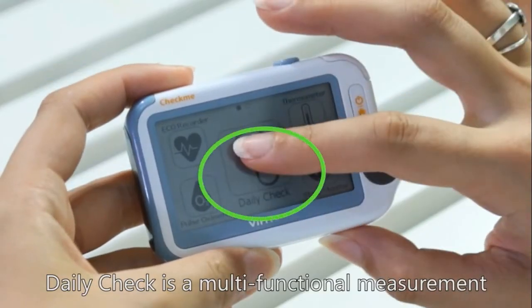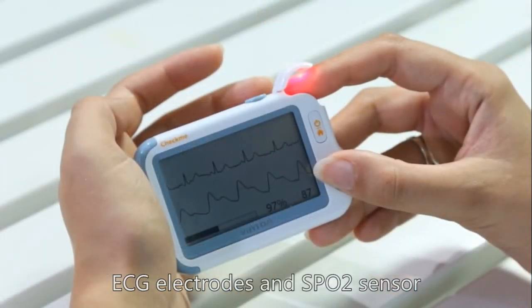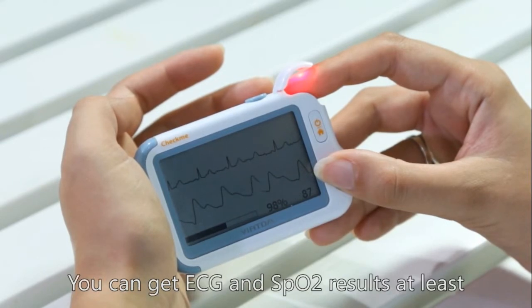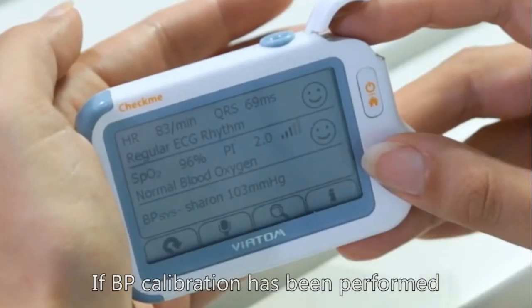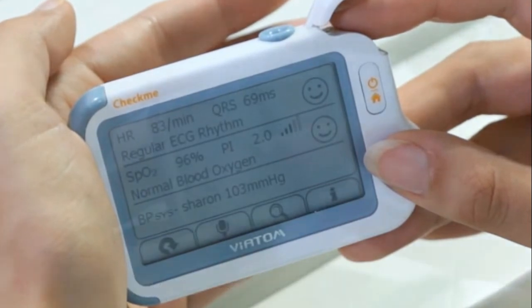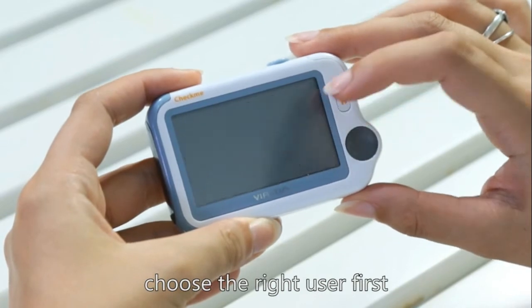Daily Check is a multifunctional measurement. ECG electrodes and the SpO2 sensor are used at the same time. You can get ECG and SpO2 results at least. If BP calibration has been performed, you may also get systolic blood pressure. To start Daily Check, choose the right user first.